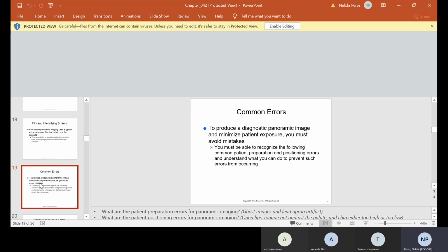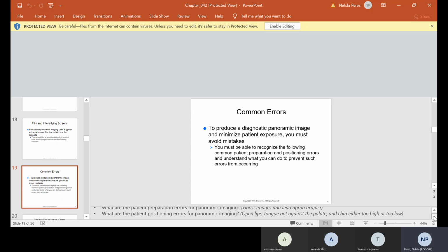And believe it or not, if someone is wearing a metal hair clip or any type of clips in the hair, those need to come off too, because they do show up on the x-rays. Anything with a metal clip. One time, we were trying to figure out for the longest time what was inside the panel, and it turned out to be the little metal clip from a ponytail holder. We wondered what the heck that was until we looked in the patient's hair and saw that their ponytail holder had a metal clip. So things like that can ruin your x-rays.